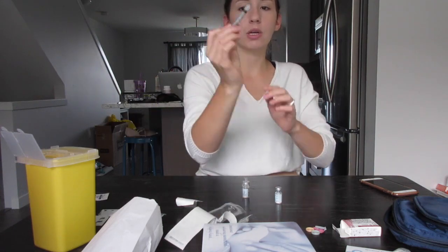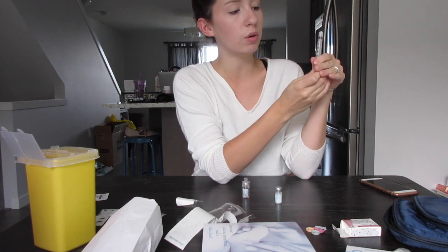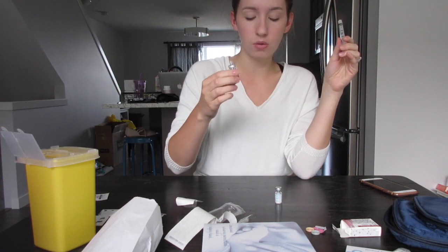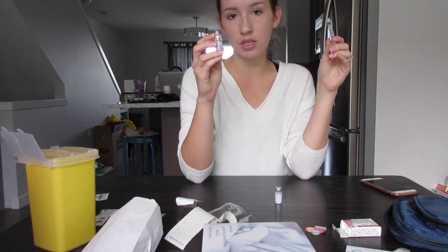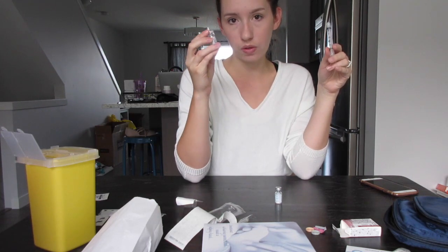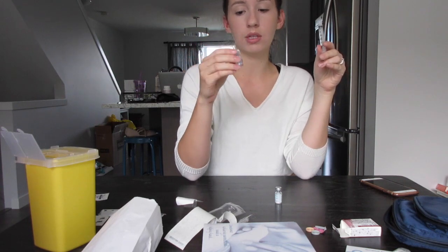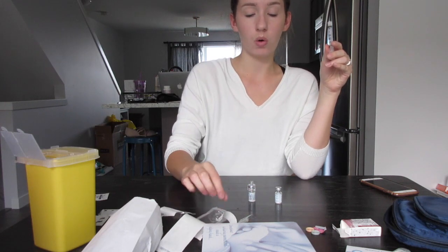Then I take my syringe. So it's important to put in, so my dosage is 75 units. So I only need half of the liquid that's in here. I only need to go up to the number one. They just put in extra. So that's something you should definitely make sure you understand when you're doing this, is if your vial has more or not.